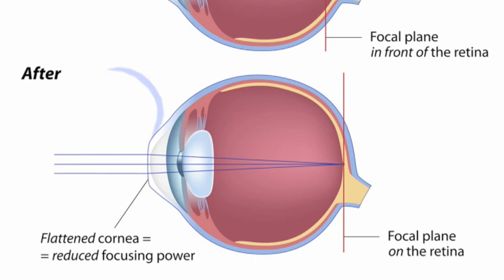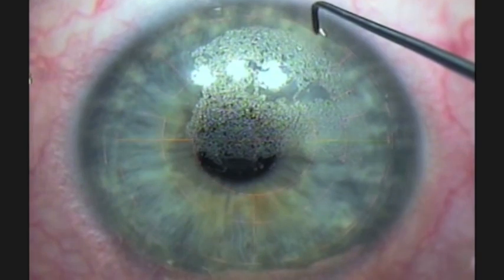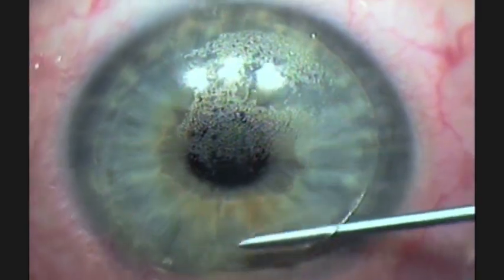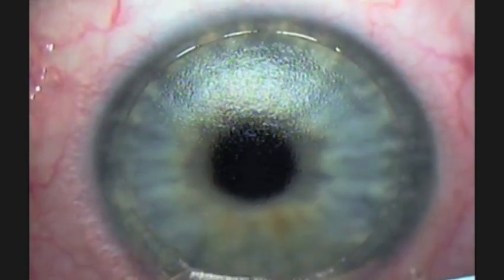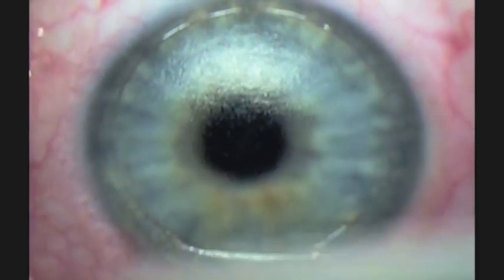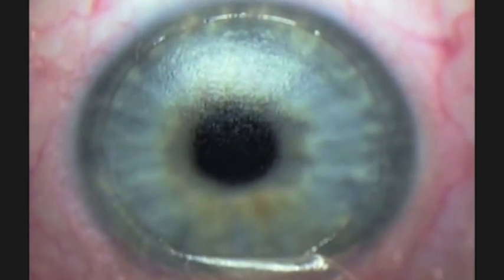Think of the cornea like a book of 500 pages. With the femtosecond laser, we have created a 100-page flap. We lift that flap out of the way, and then we will do the reshaping of the cornea in the remaining 400 pages, and put that 100 pages back in place. So here we open up the flap — it's very easy to do because it's already been separated — and then flip that flap back onto a hinge. That acts as a natural bandage. We dry the surface and prepare the surface of the eye for the excimer laser.